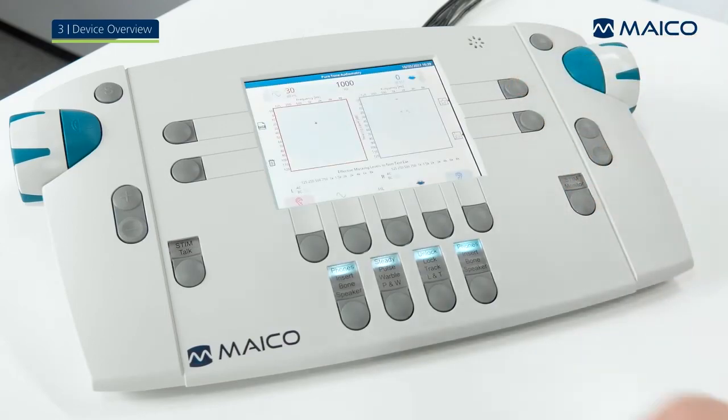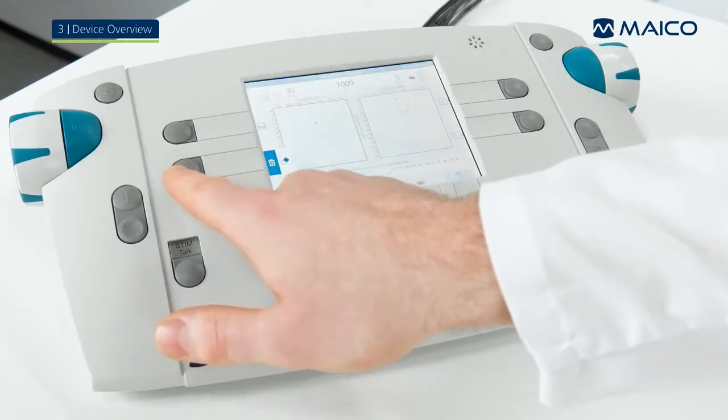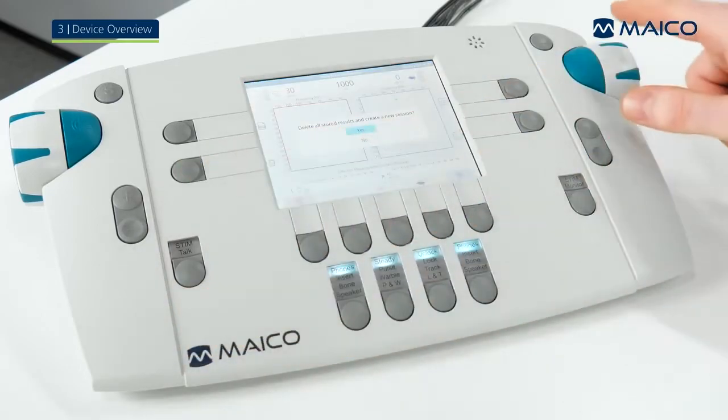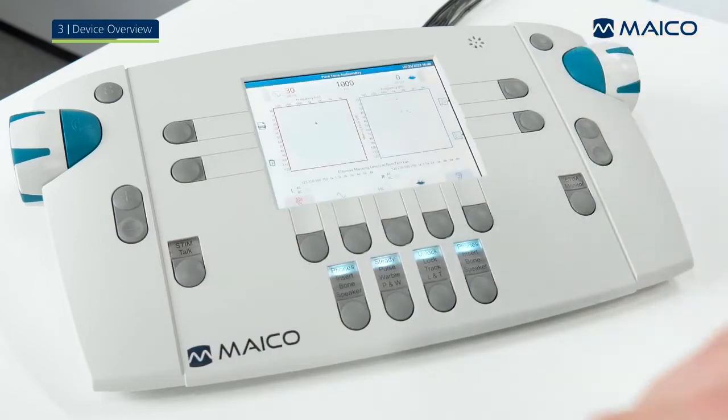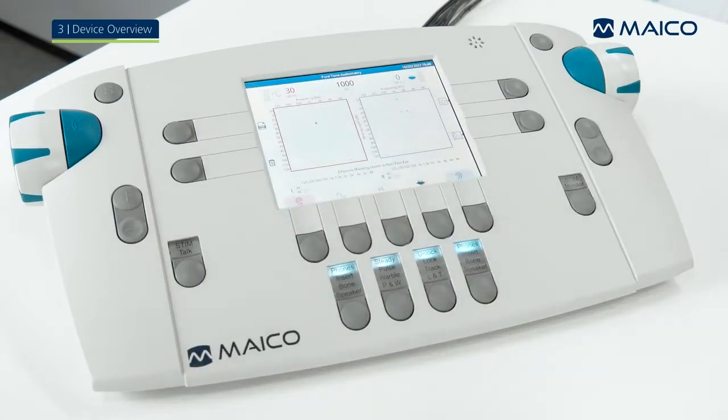On the left side of the screen are the data management functions. Delete to start a new session or delete a single point. And print to save the data as a PDF report or create a thermal printout.